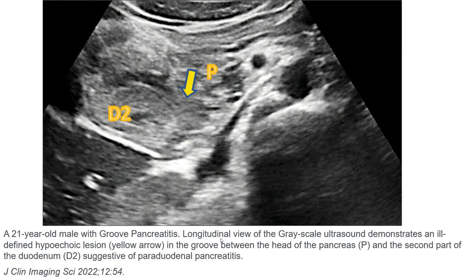This is what we can find on ultrasound of a 21-year-old man with groove pancreatitis. On the longitudinal grayscale ultrasound view, an ill-defined hypoechoic lesion — indicated by the yellow arrow — is seen in the groove between the head of the pancreas and the second portion of the duodenum, suggestive of groove pancreatitis.